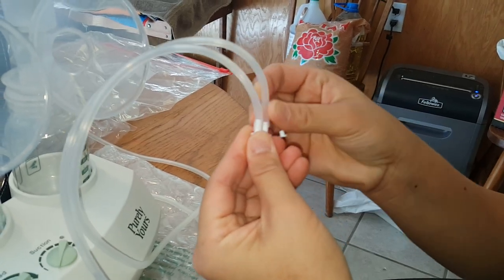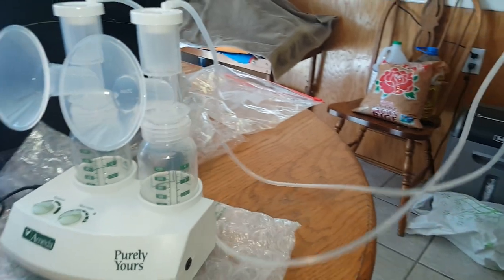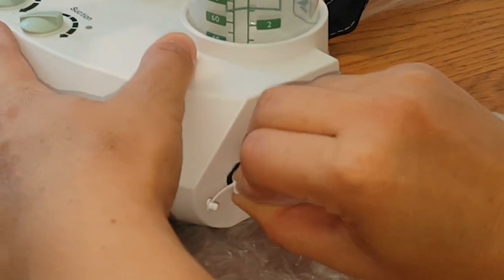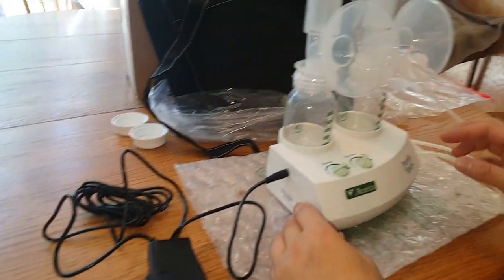But if you're going to do both sides, then you would put both of them in and hook it up right into this space here. So let me hook this up and then I'll show you all how this works.